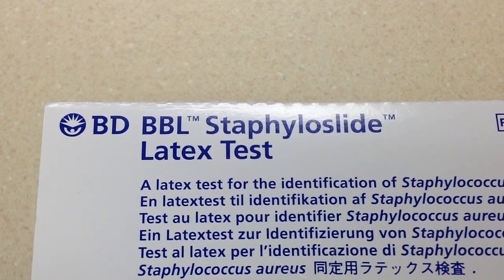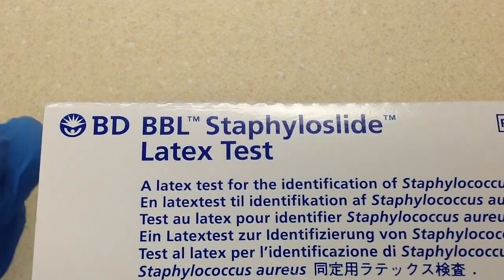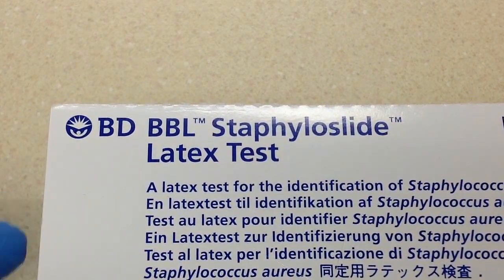In this video, we are going to run a latex agglutination test for Staphylococcus aureus, and the kit that we are using is from Becton Dickinson.